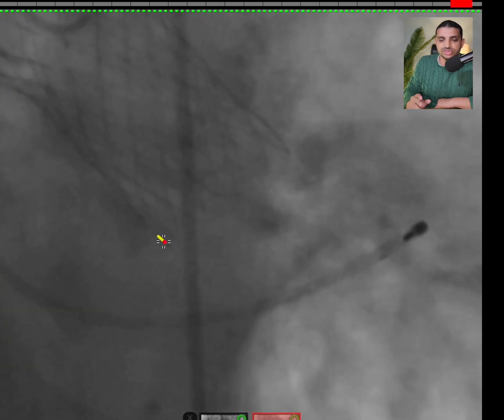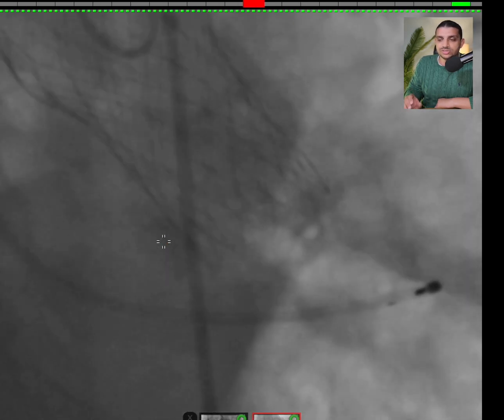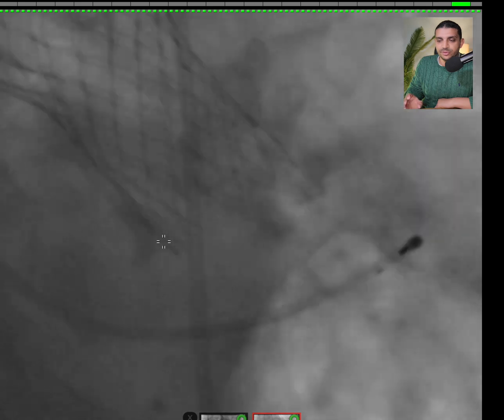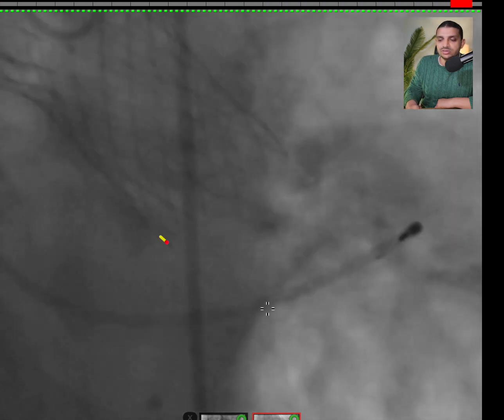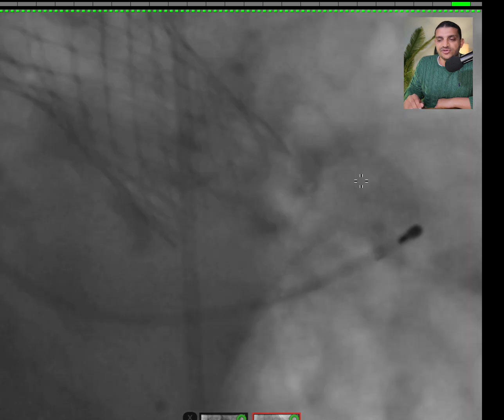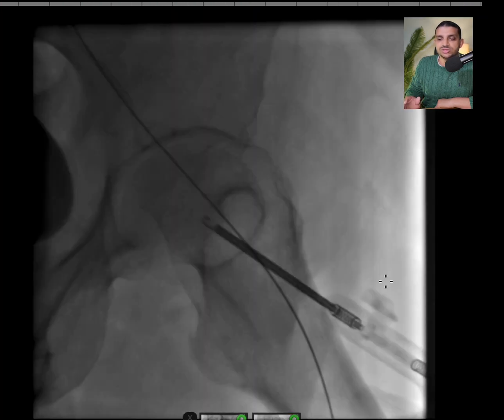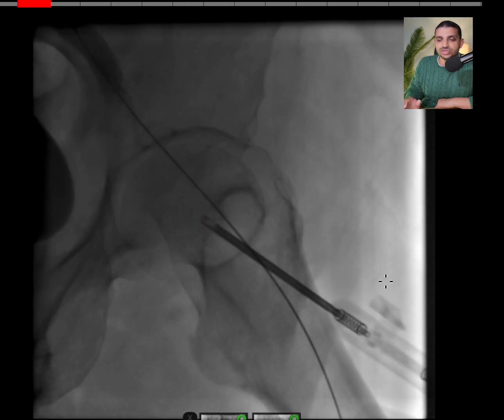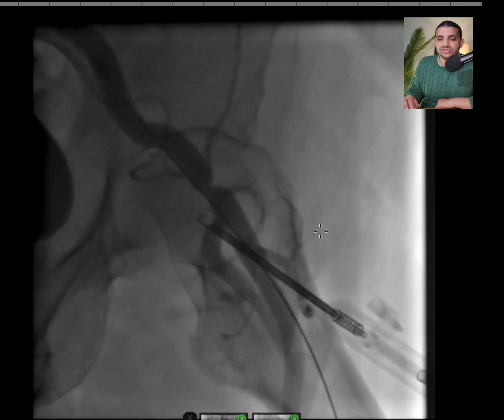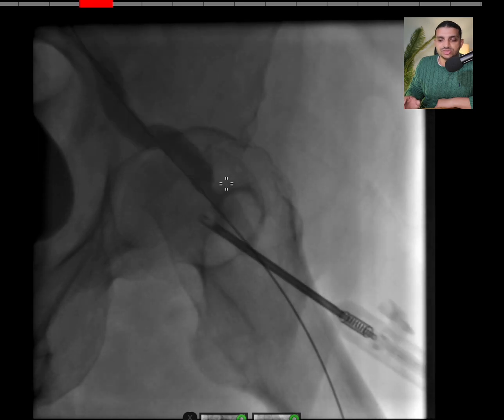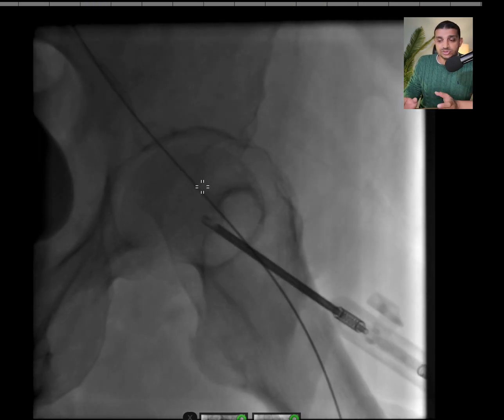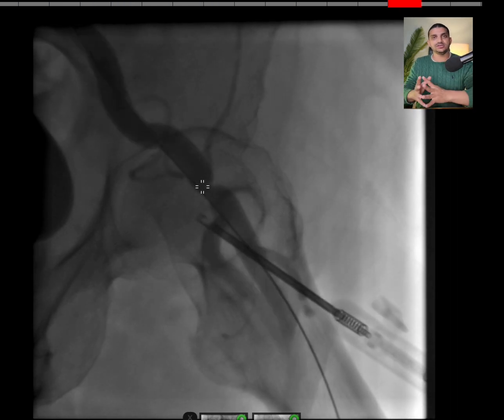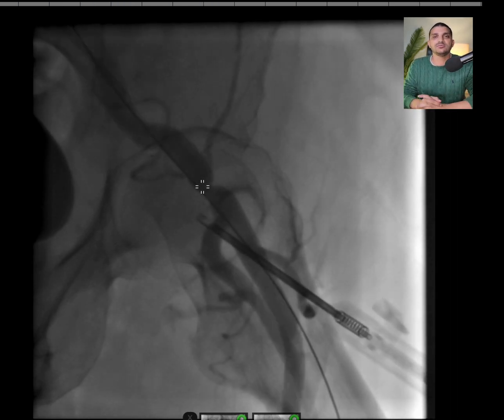Once we're done, the most important thing to make sure — as you remember — is to check: there are no blocks. If there is a block, don't remove the pacemaker. And there is no paravalvular leak. Finally, you make sure that you tighten the proglide sutures. You can see there is a bit of stenosis; however, it's not high-grade stenosis and there's no effect on the flow. Once you're done, you remove the wire and apply manual compression for about six minutes to make sure that everything is fine.